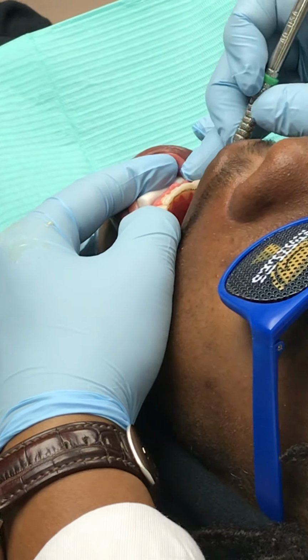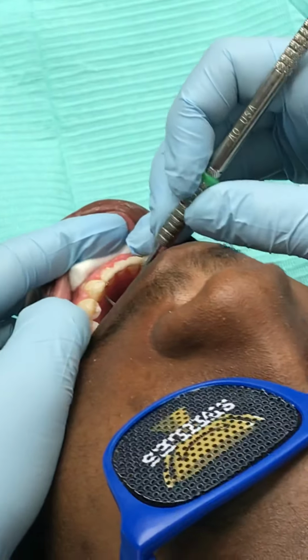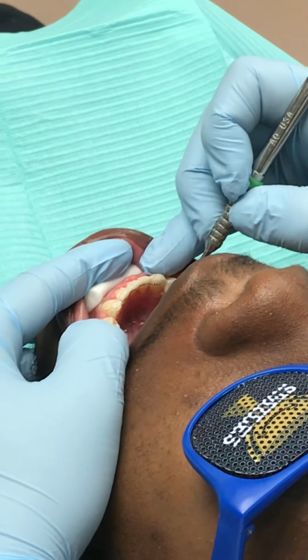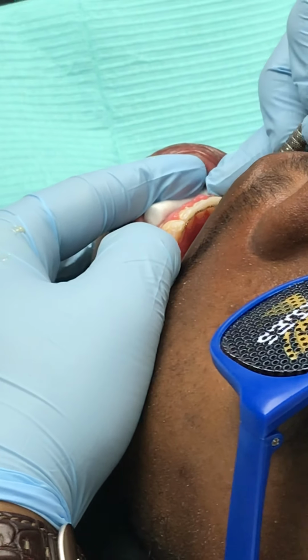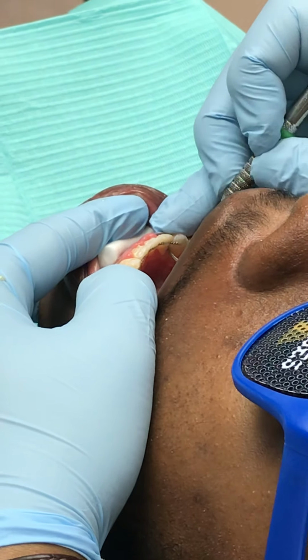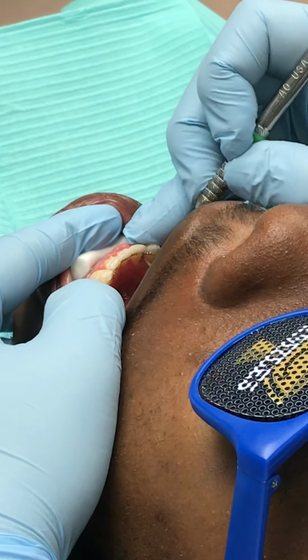Before I add that material, let's just point out something else. Number 1, you can see we didn't get anywhere near the gum line on any of the teeth, okay? Number 2, we also didn't get anywhere near the contacts. So there isn't any adhesive in between the contacts, so the patient's going to be able to floss in between the teeth just fine. There's a little bit of calculus that's still here, it looks like. So when he gets his cleaning, they'll be able to remove that.